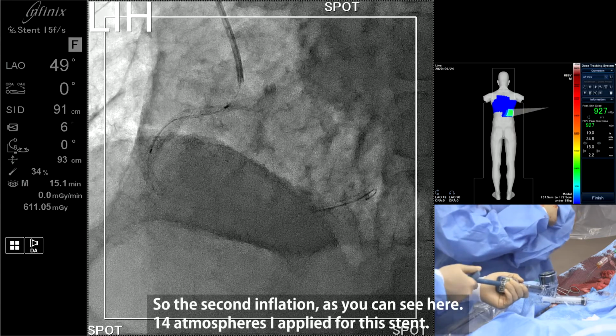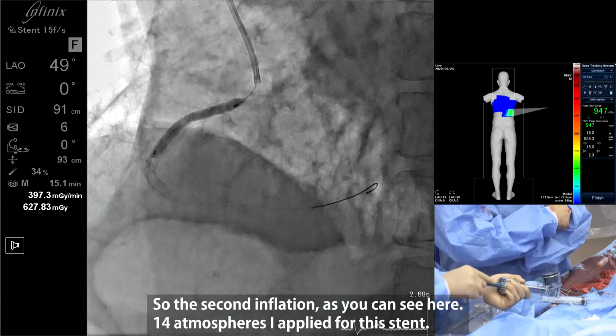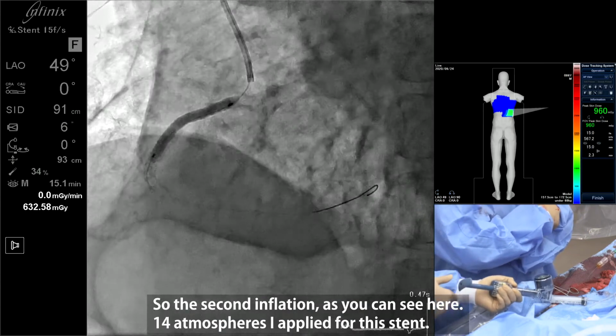So second inflation, as you can see here, 14 atmospheres I applied for this stent.